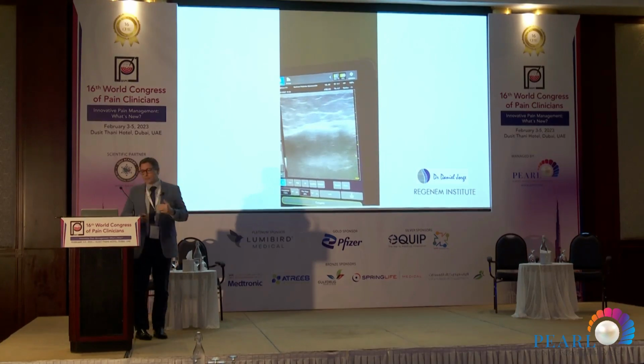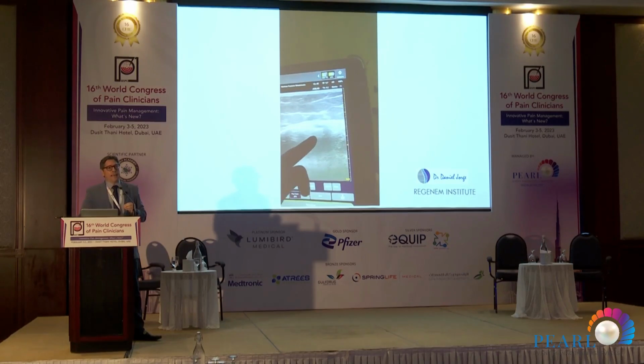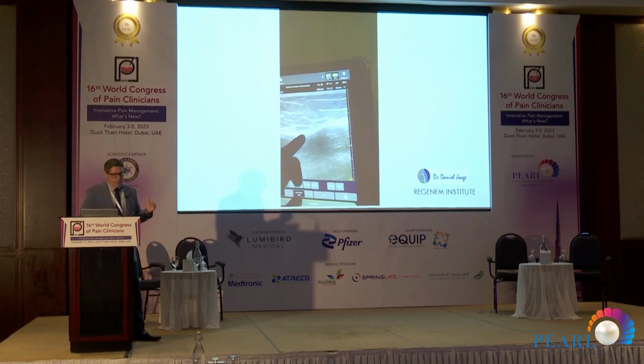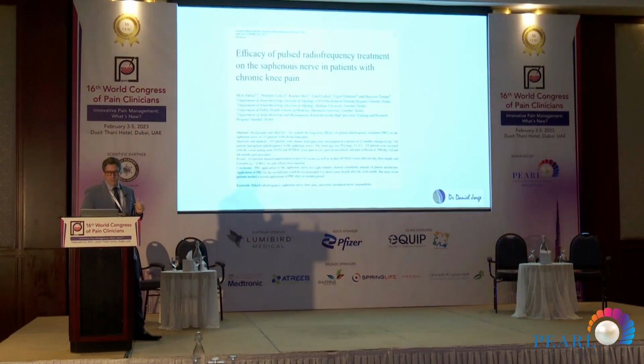It is quite an interesting procedure with the ultrasound, because you can make the diagnosis of your patient in the clinic. You can see the joint, you can see osteophytes and other alterations of the joint, and then you go down there, you see the curve. When you have the curve down there, you are probably near the nerve. You can put your Doppler on, and you will see the vessel just beside the nerve, to be exactly on the point.